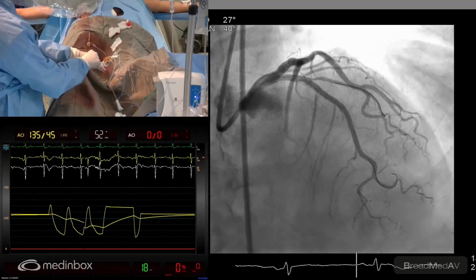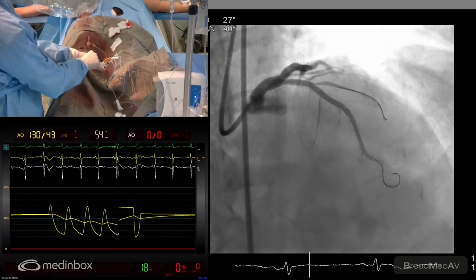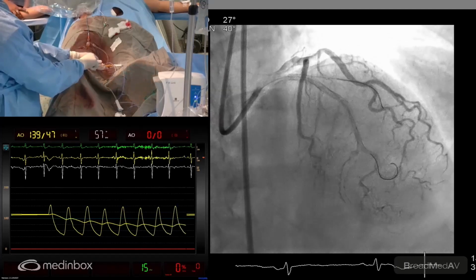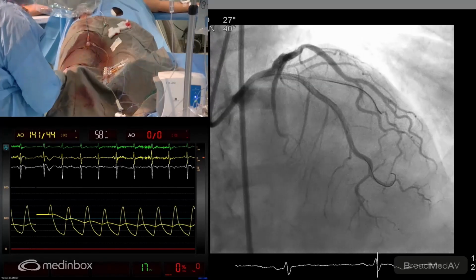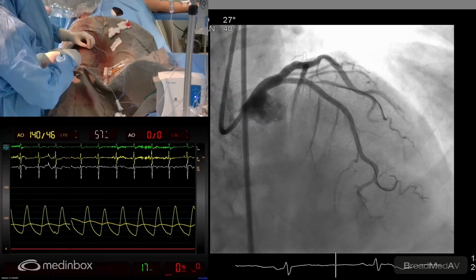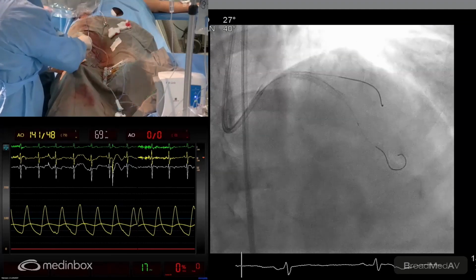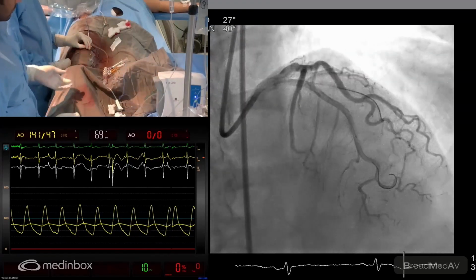Okay, so you can see that the stent is nice and uniformly expanded. So there was a suggestion to take a 3.25 balloon. Okay, I think that may be good. We can do both, 3.25 and go very high pressure in the proximal part, and then check what we have to do and then use a 3.5 if required.